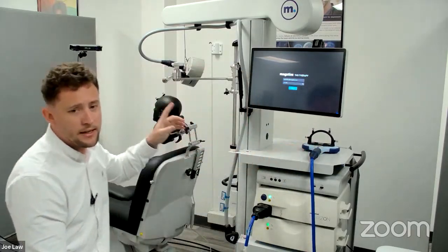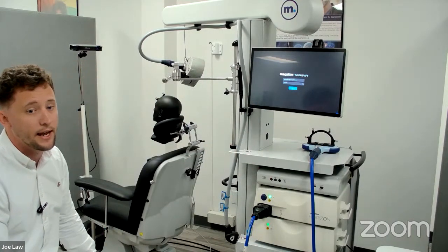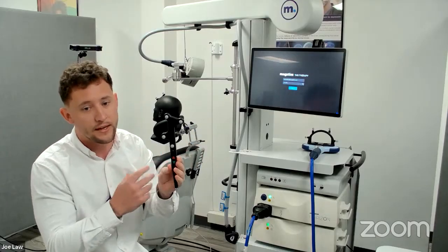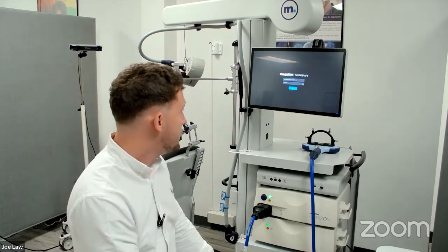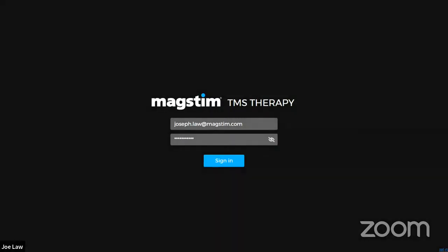You'll see behind me here, this is our infrared tracking camera that is used for the navigation process. The camera is going to look for certain reflective spheres on certain tracking devices, and I'll show you how that works a bit more when we actually get into the treatment itself. So what I'll do now is switch you to the screen mode so you can see what I see on the screen. And then I'll also, in a minute, share the actual treatment camera as well.